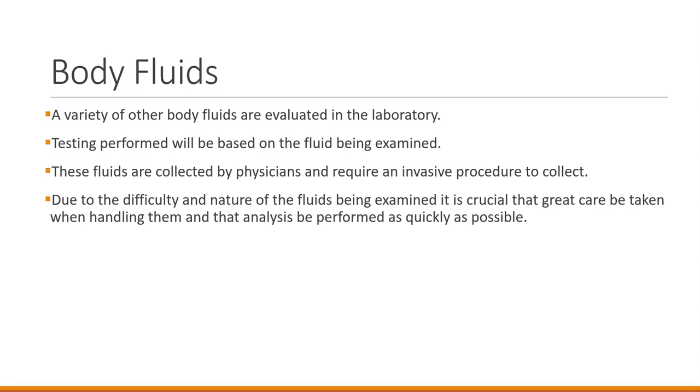So blood and urine are the two most commonly tested samples, but there are additional body fluids that are evaluated in the clinical laboratory. Testing performed will be based on the fluid being examined. These fluids are collected by physicians and require an invasive procedure to collect, which is not you. Due to the difficulty and nature of the fluids being examined, it is crucial that great care be taken when handling them and that the analysis be performed as quickly as possible. These fluids are very precious due to where they came from and the procedure to collect them.